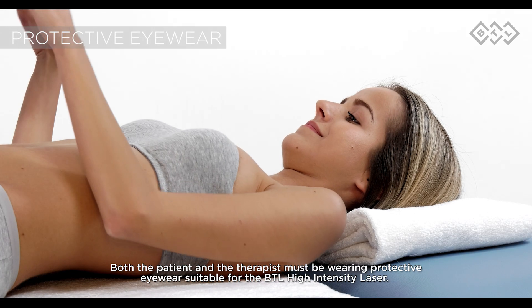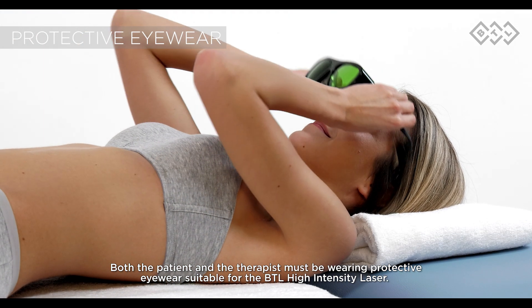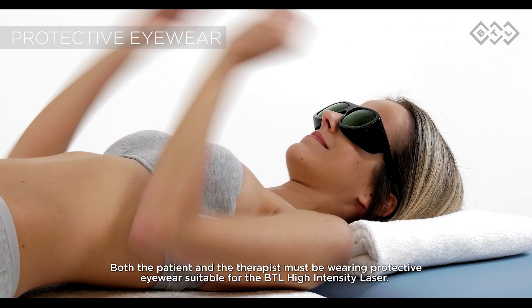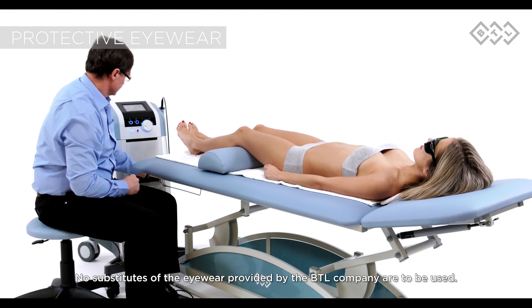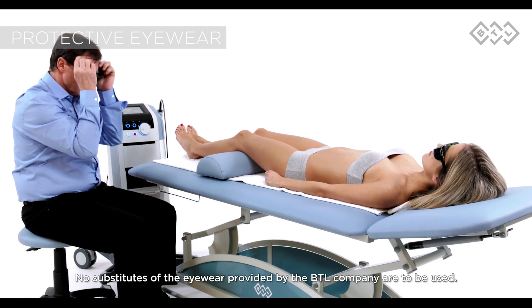Both the patient and the therapist must be wearing protective eyewear suitable for the BTL high-intensity laser. No substitutes for the eyewear provided by the BTL company are to be used.